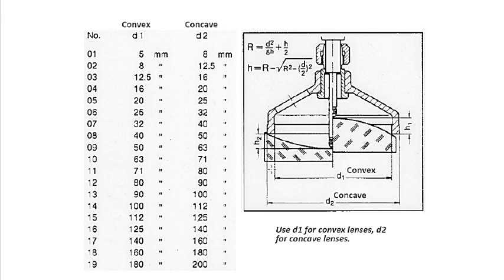I'll make it a little bit bigger so you can see it. This is your inner diameter, which is 5 millimeters, and the bigger one, 8 millimeters, is your outer diameter. The inner diameter is going to touch the convex lens, and your outer diameter is going to touch your concave lens. So it's written here: the inner as convex and the outer as concave lens.